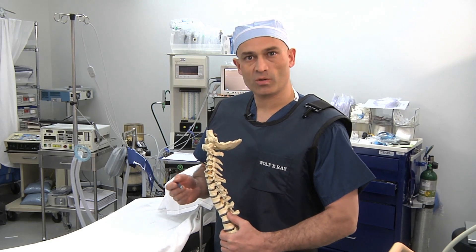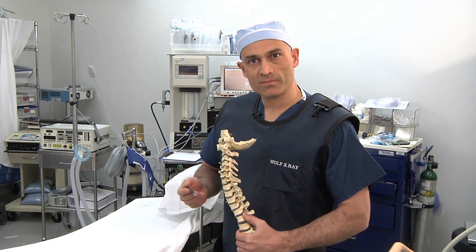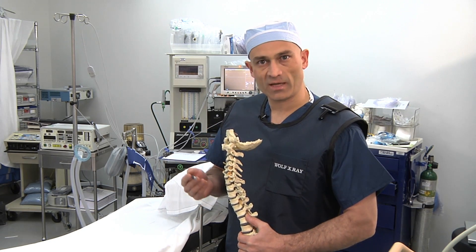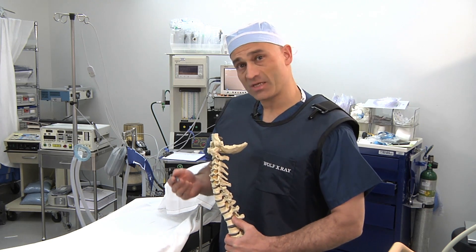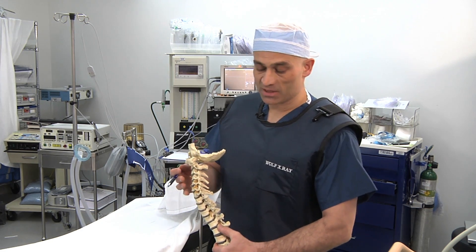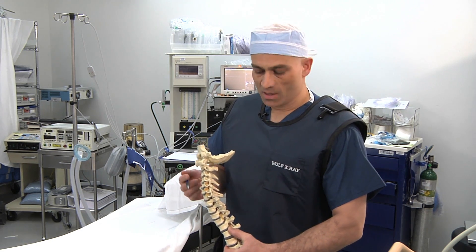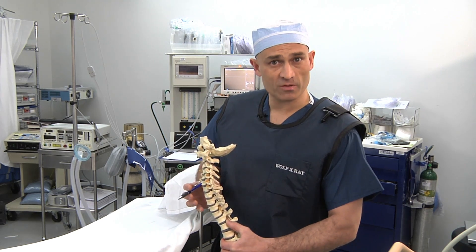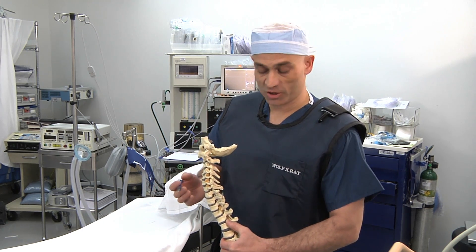Hello, I'm Dr. Richard Call with NJSR. Today, I'm going to be demonstrating a cervical epidural injection. And to demonstrate the technique, I'd like to use this plastic model of the spine to illustrate some of the anatomical features and some of the technical features.